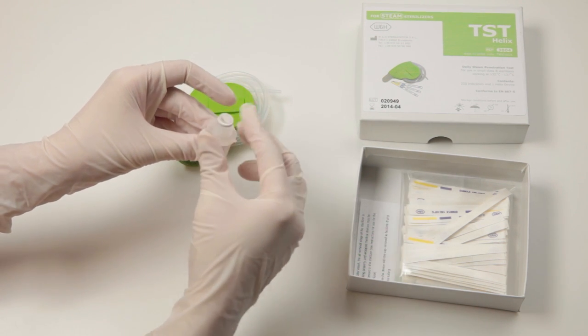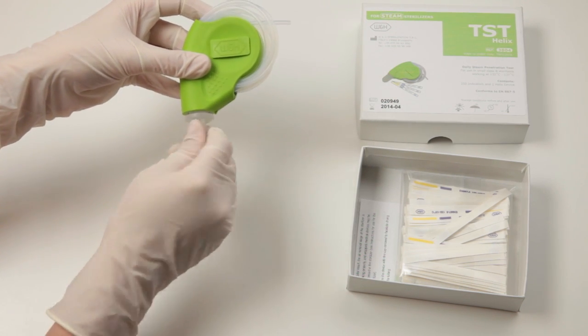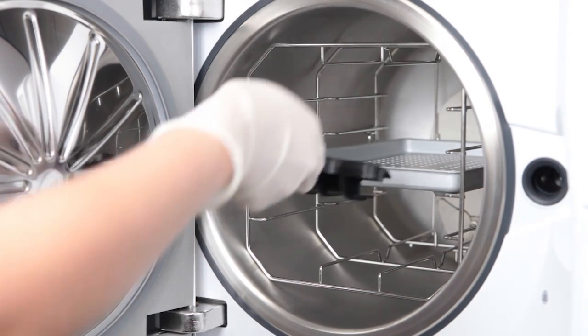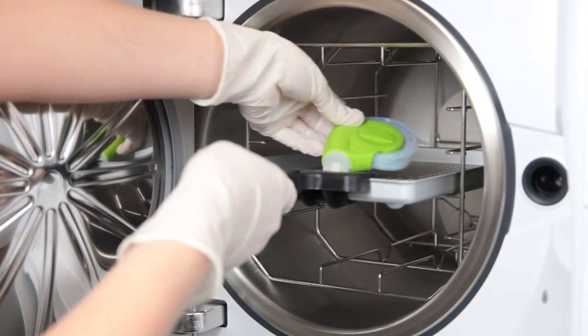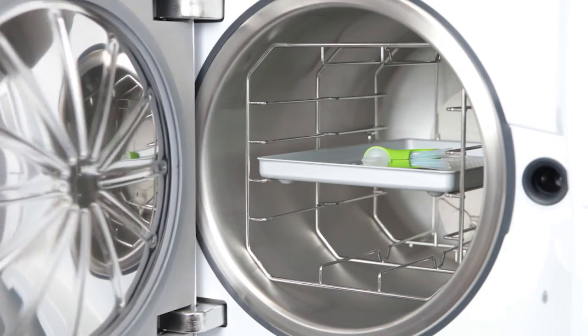Place the test device on a storage tray. Push the storage tray into the middle of a rack placed inside the sterilizer. During a Helix test cycle, the test device must be the only thing inside the sterilizer — there must be no dental instruments inside the sterilization chamber at the same time.